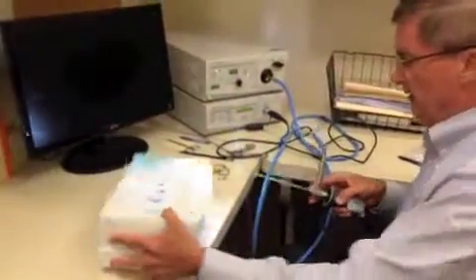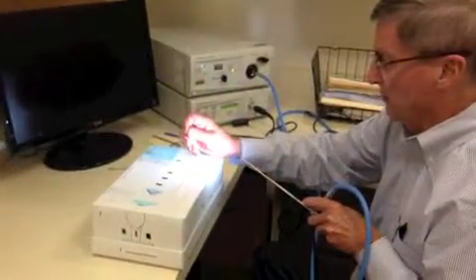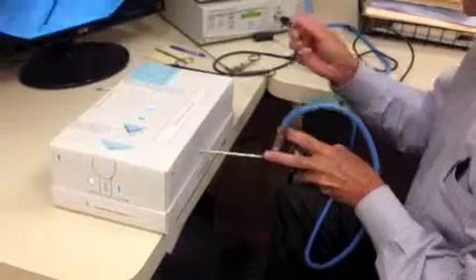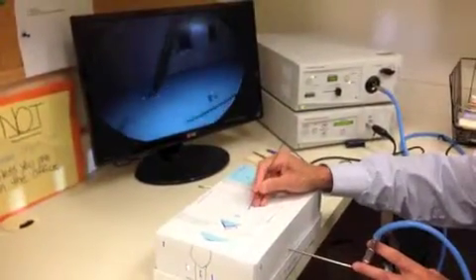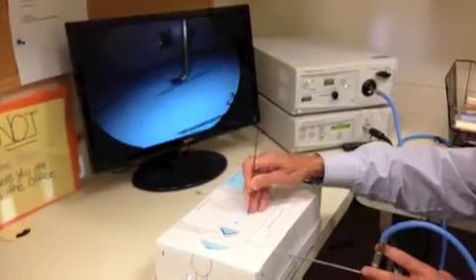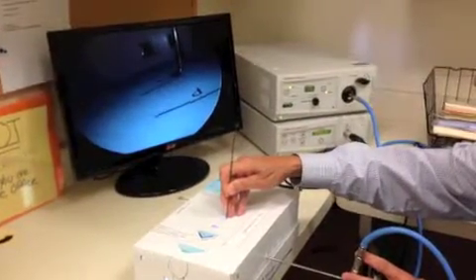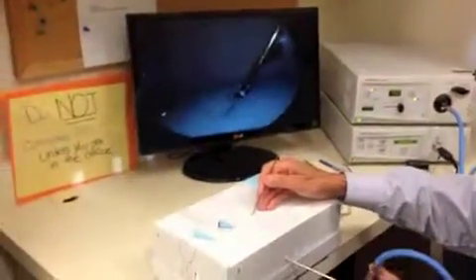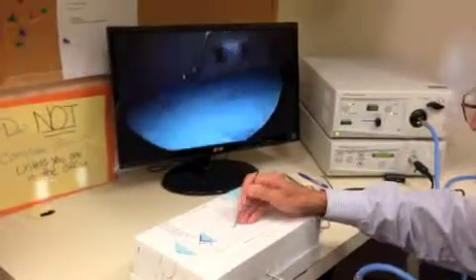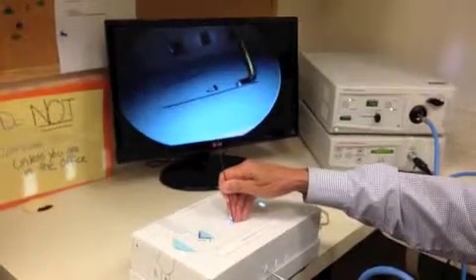Task number four is measurements. We have our probe, which is five millimeters in size, and we have four lines to measure. Line A is about the same as the end of the probe, so that's five millimeters. Line B is about three lengths, so that's about 15 millimeters. Line C is about two widths, so that's 10 millimeters. Line D is about four lengths, or 20 millimeters.